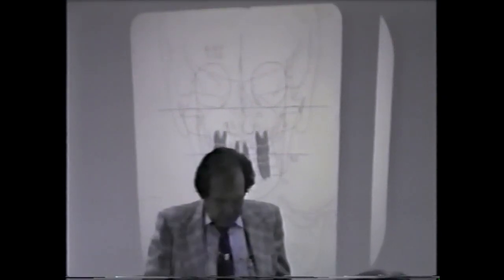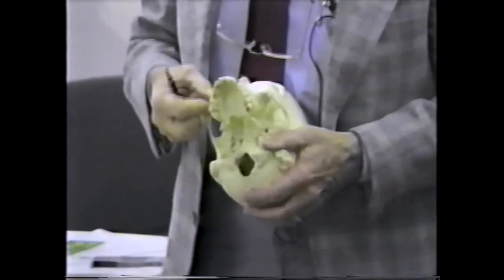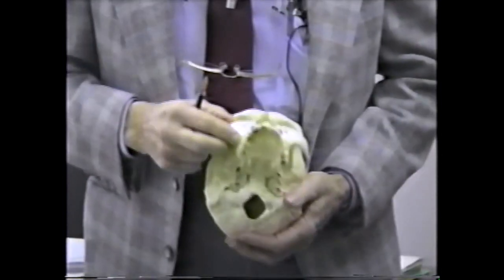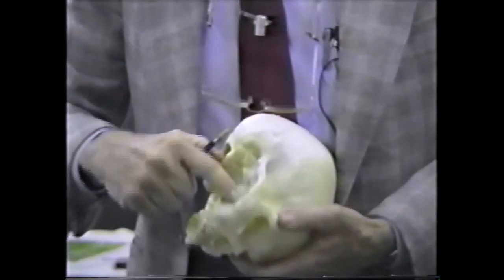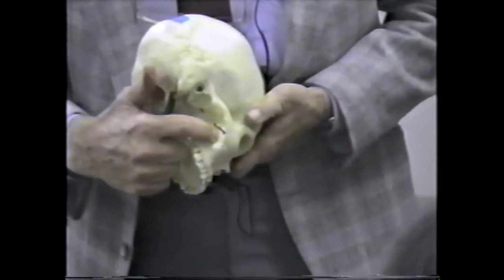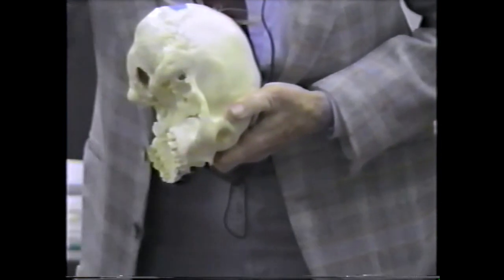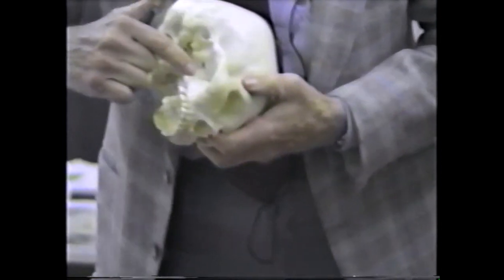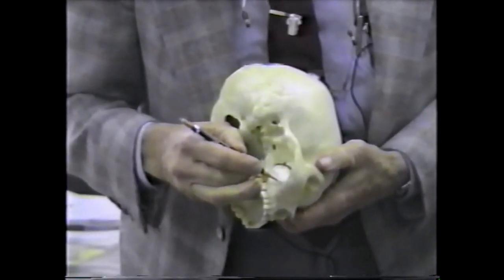We want to place on this curve someplace because that's bone that stays, because that's carrying the stresses up through here. Usually when you take an x-ray, the tuberosity, which is back here, will show you a little line there. So where this crosses over that, right there, just about, is what we use as point jugale.